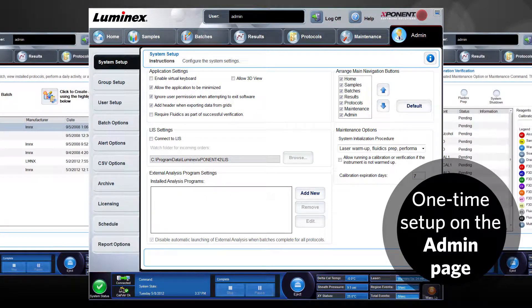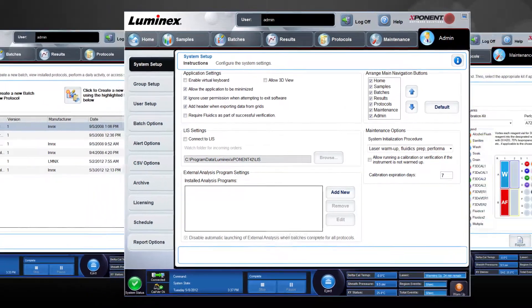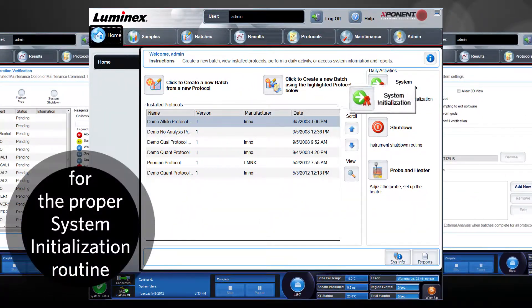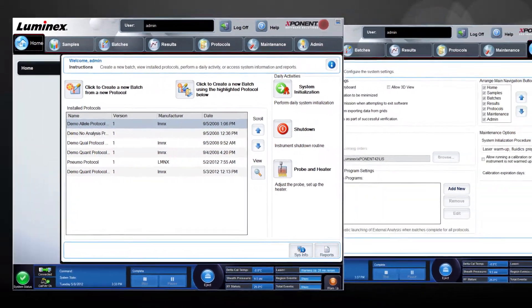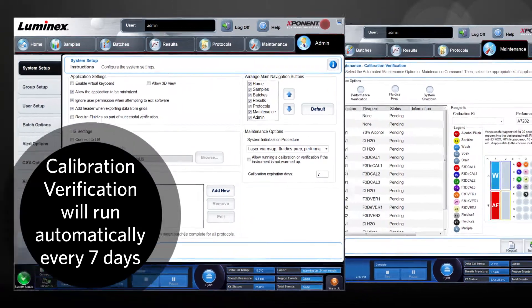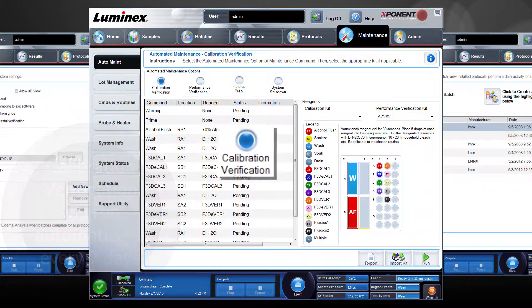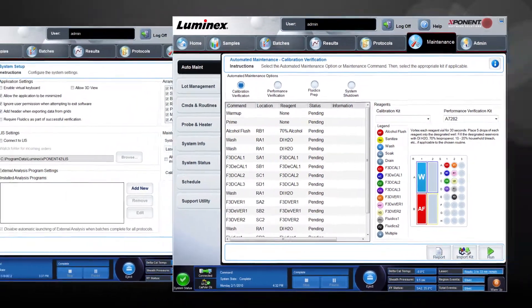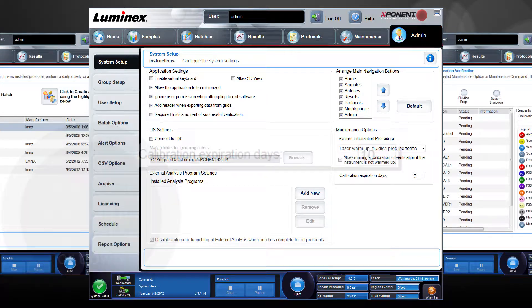After a one-time setup on the admin page, daily and weekly system initialization can be easily accomplished by clicking the system initialization button on the homepage each day. Every seven days, clicking the system initialization button will automatically run the system initialization routine that includes calibration. This number of days can be adjusted up or down depending on the standard operating procedure of the lab.